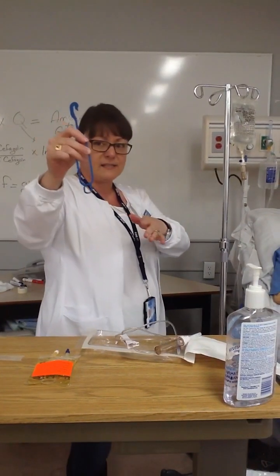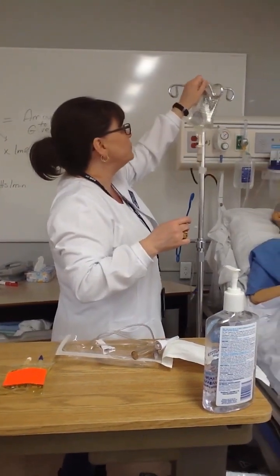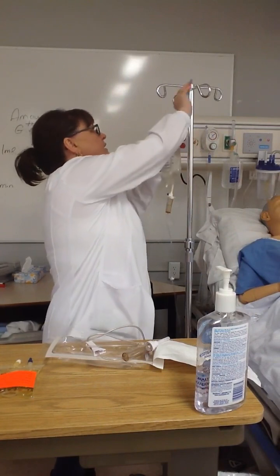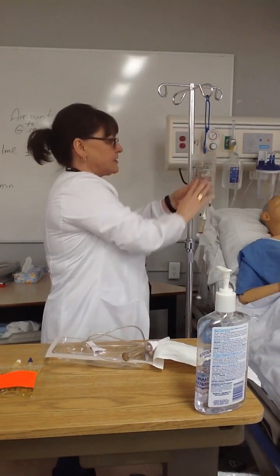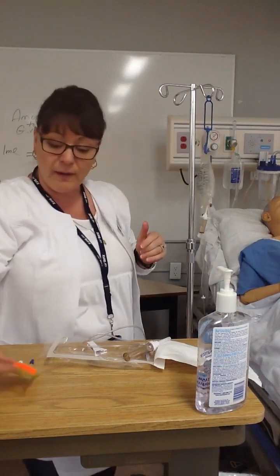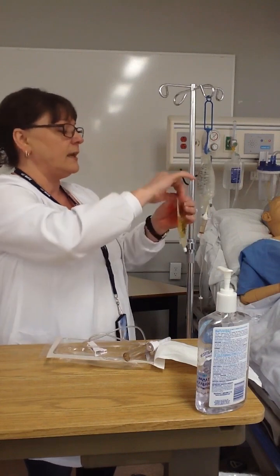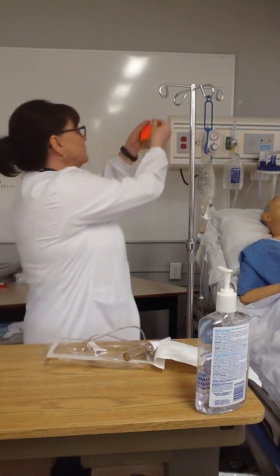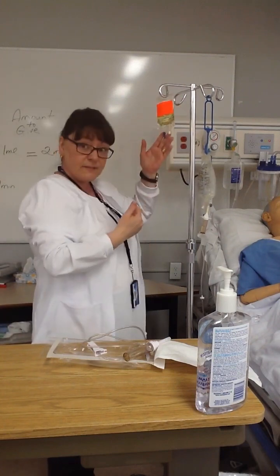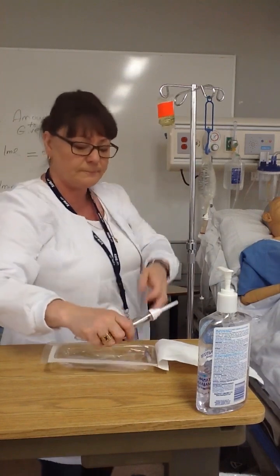So this little mechanism or hanger that comes in the secondary set is for you to drop down your primary set. So you put the hook in your primary solution that's running, and then that's going to drop the primary set down lower. And then we're going to go ahead and take our newly prepared medication, and I'm going to hang that on the IV pole with the label facing me. I'm always looking at that label. I'm always checking my work.